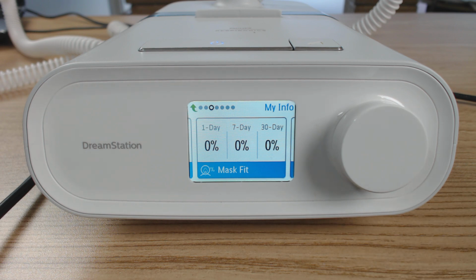Now, if you're having lots of mask leak through the night, so your mask isn't sealing well, that percentage is going to drop down. If you're getting a value of, say, 80%, it means that for 20% of the night, the machine wasn't able to deliver the correct amount of pressure. Or if you have an automatic machine, the machine wasn't able to determine the respiratory events correctly, with statistical accuracy. So we want to get that as high as possible in terms of the percentage.